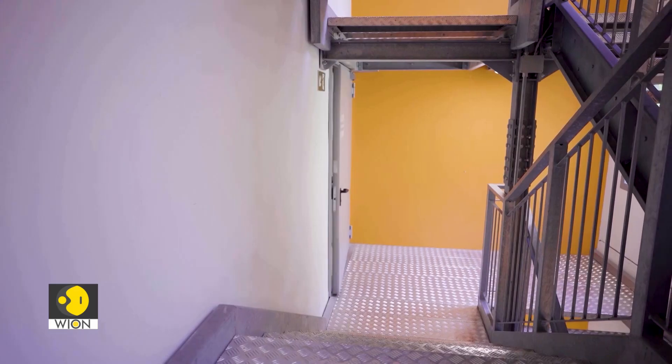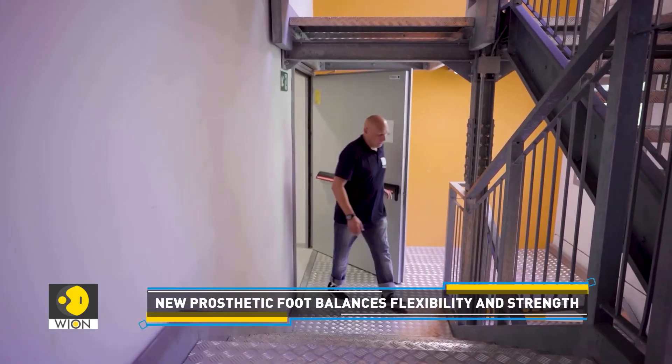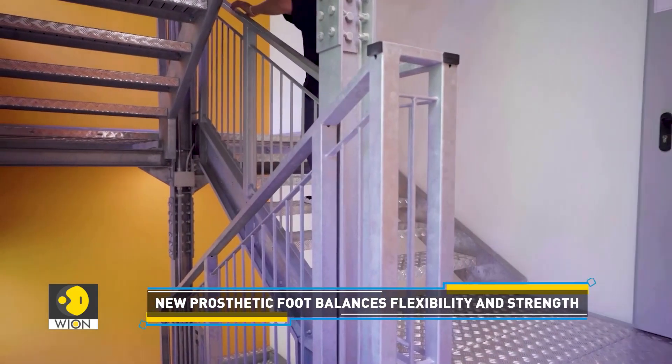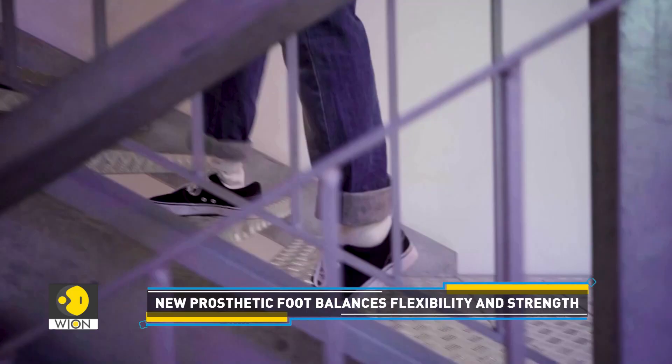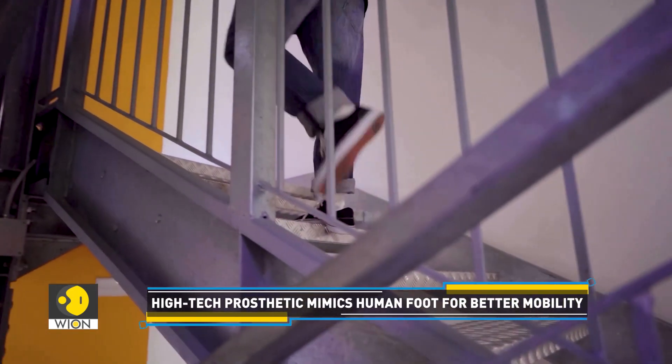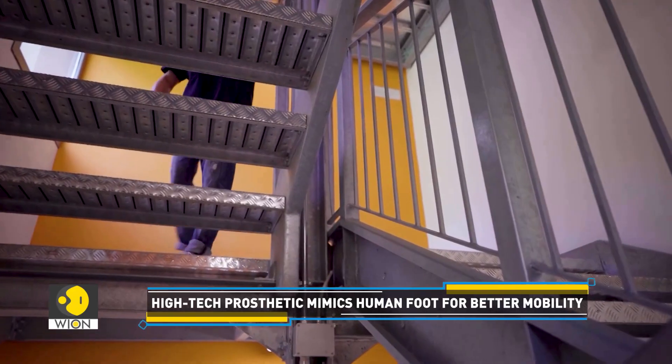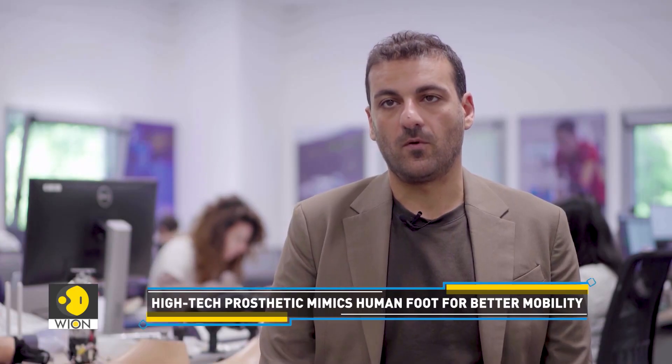We are trying to have a system that users can adopt every day in their life without changing the feet for specific tasks. This means that we can use this prototype in every condition of our life — in a humid environment like water, but also in a work environment that can be difficult for people to address with conventional feet.